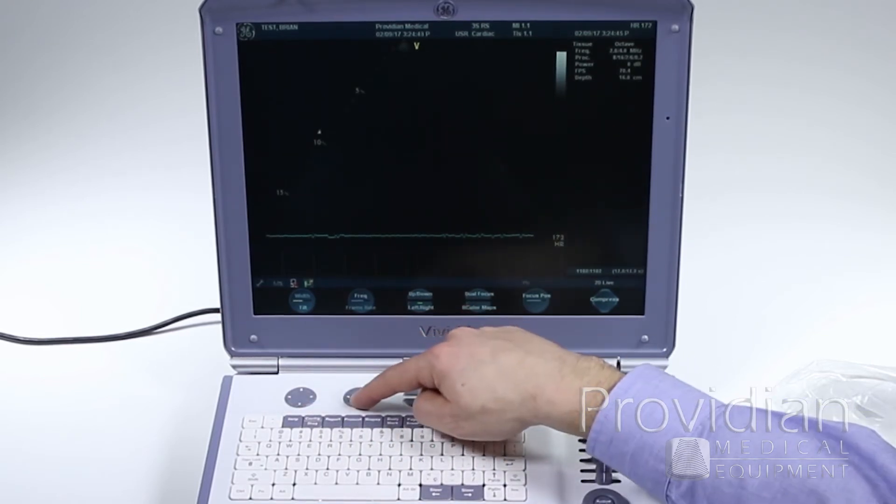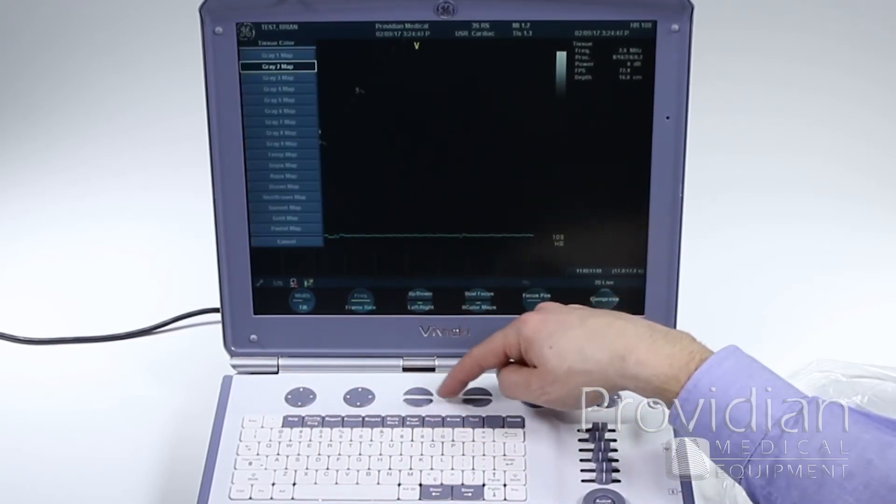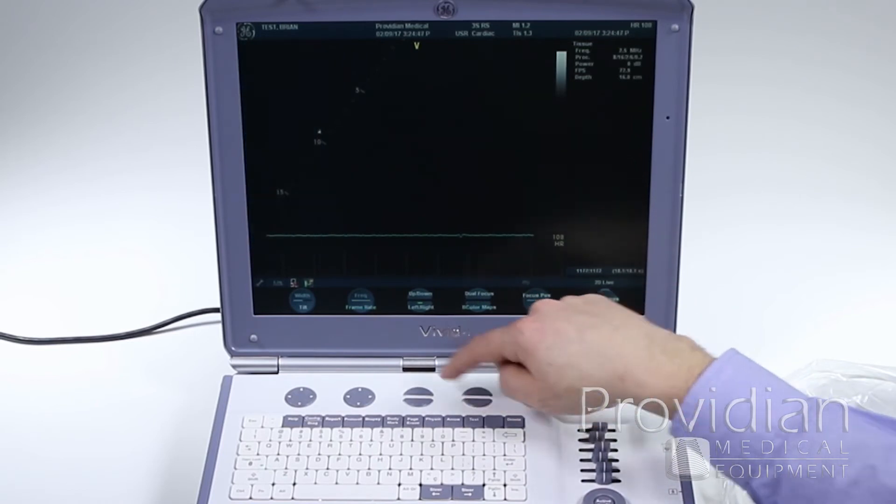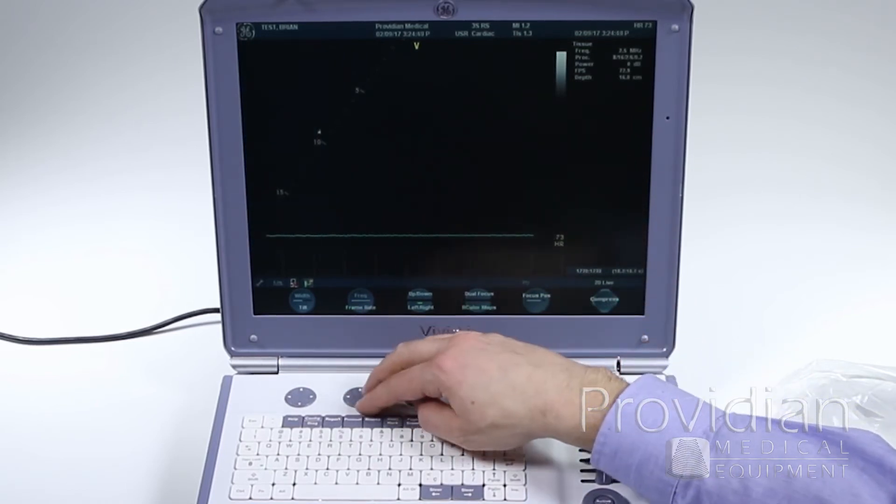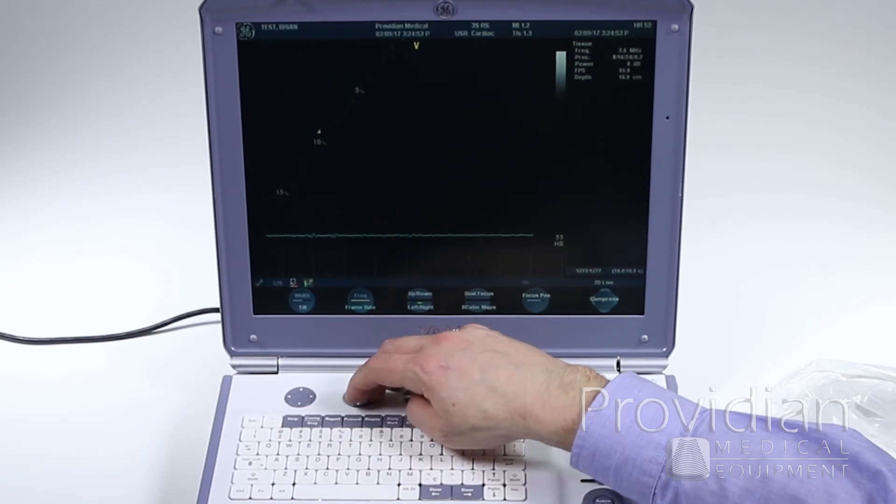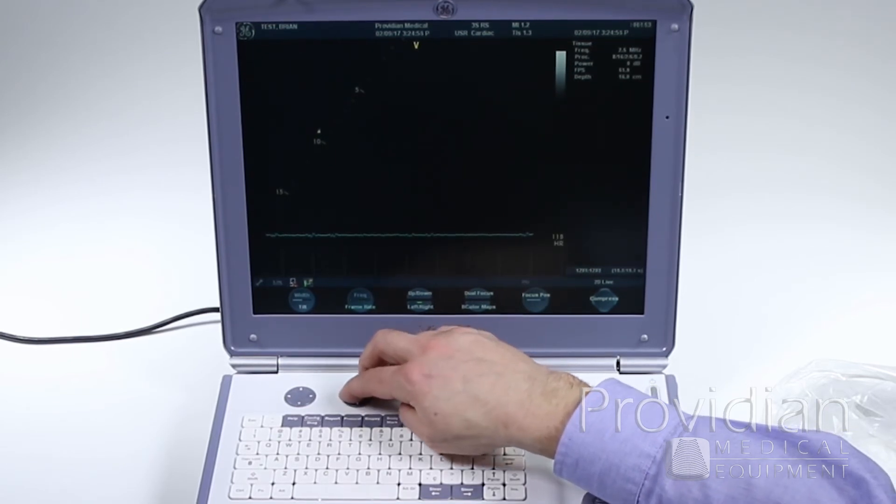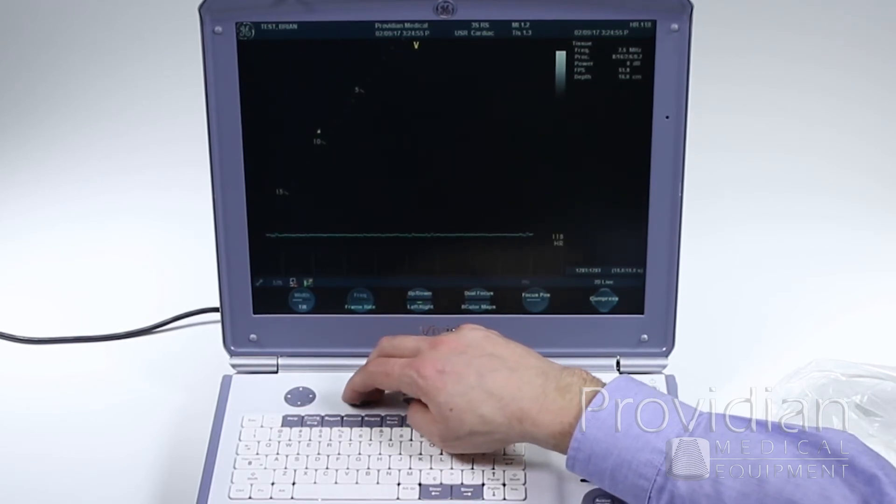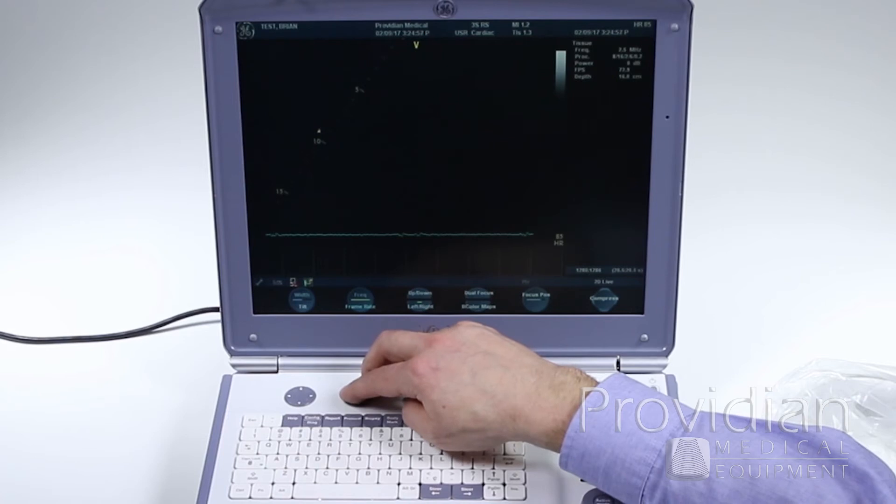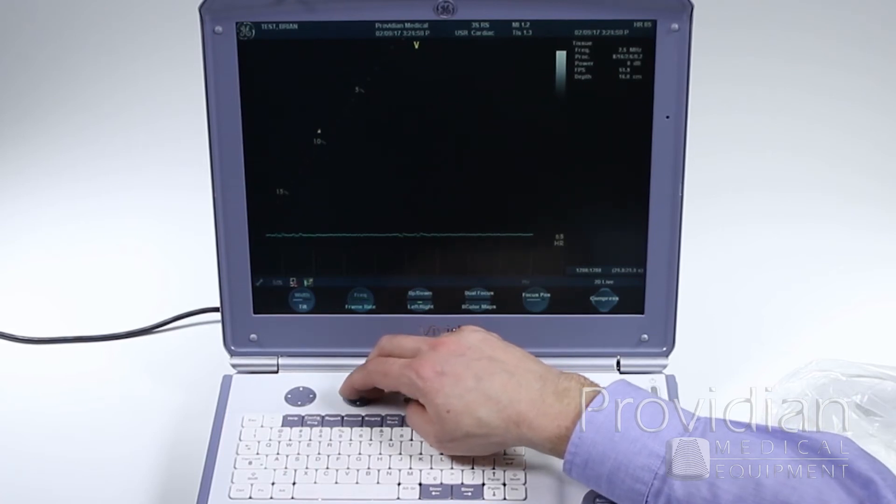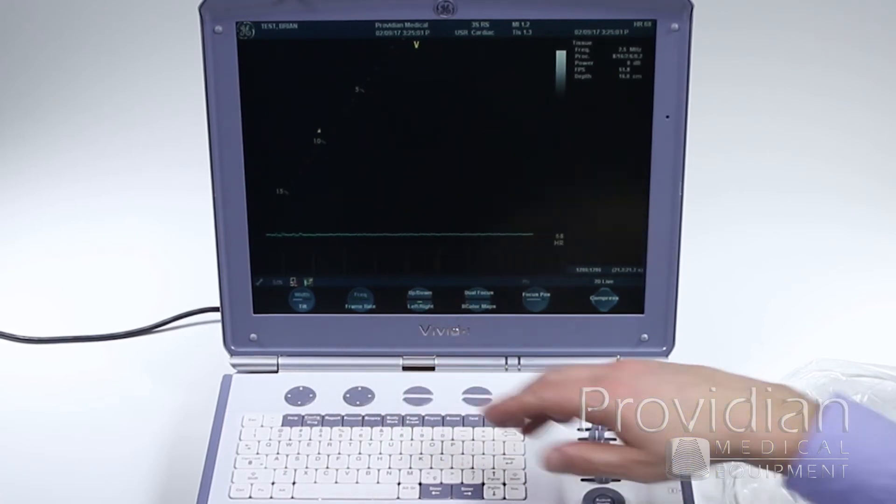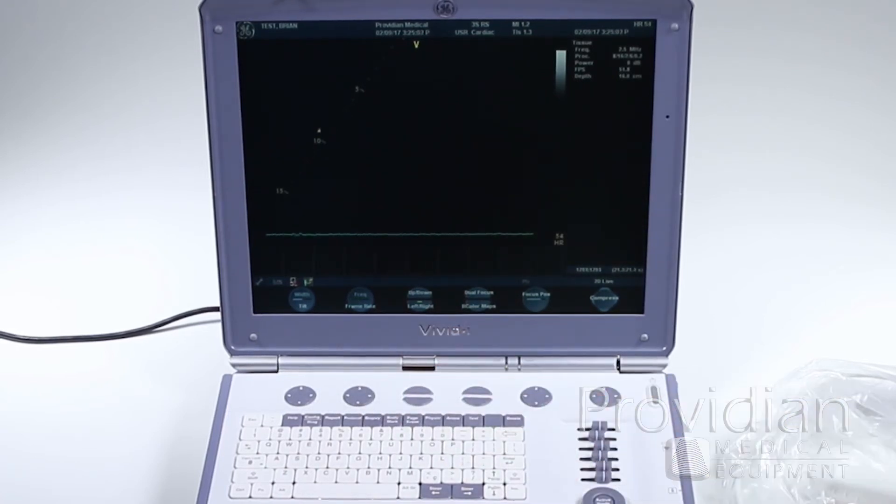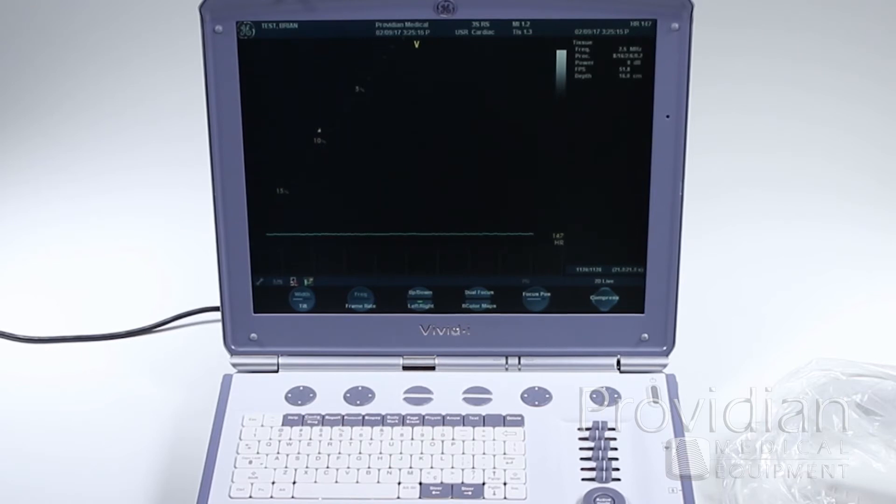Same thing with frame rate. If I click frame rate and it's highlighted, I can change the frame rate. The higher the frame rate, the more things it's going to adjust. So you're going to lose possibly some image quality with a higher frame rate. Lower frame rate will adjust multiple things that will trade your frame rate for image quality. Lower the frame rate, higher the image quality; higher the frame rate, lower the image quality.